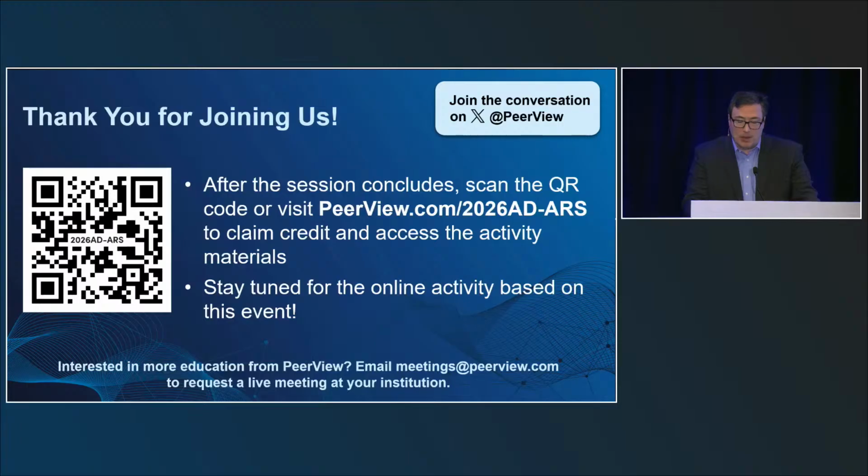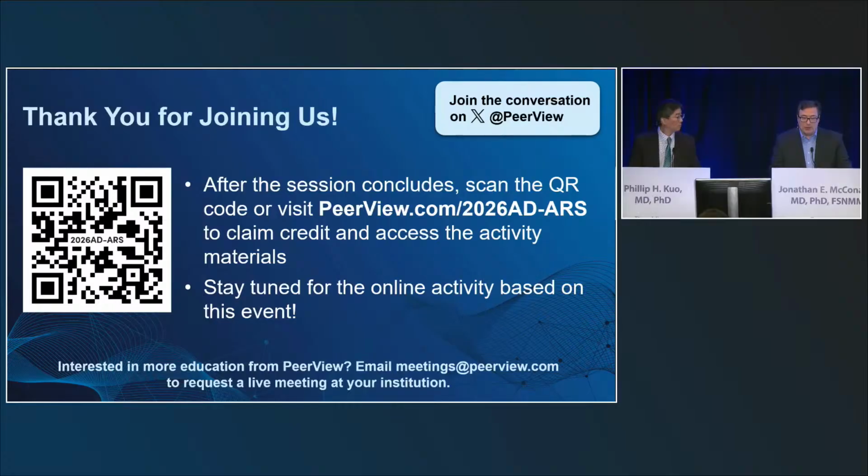The one thing I would add, especially if you're really using gray-white contrast as your interpretive criteria, I've seen a few people who have really bad white matter hyperintensities. That can lower the accumulation of amyloid PET tracers, and that can affect the gray-white contrast. Not common, but I have seen a few cases that have unusual appearances or even potentially false positives because of extensive, and I'm not talking about a few white matter hyperintensities, but extensive ones.